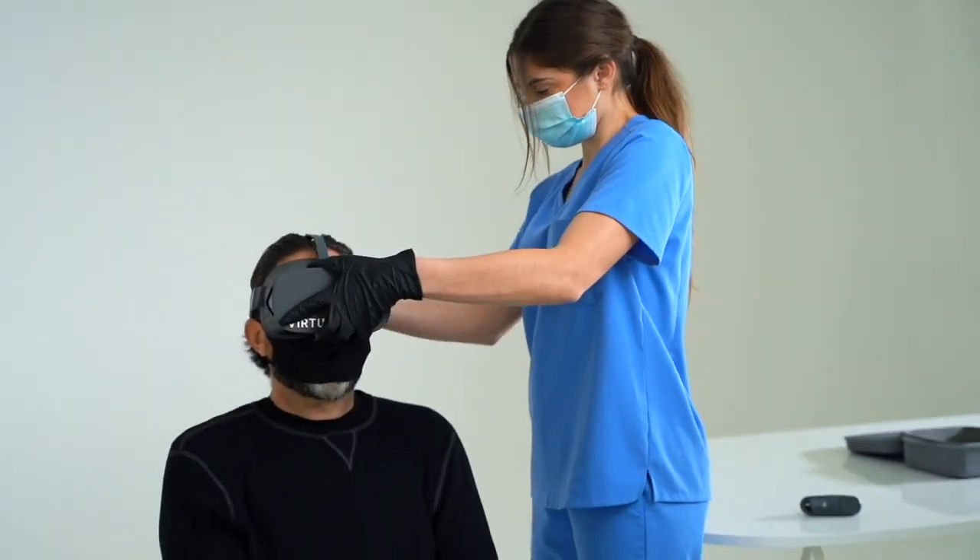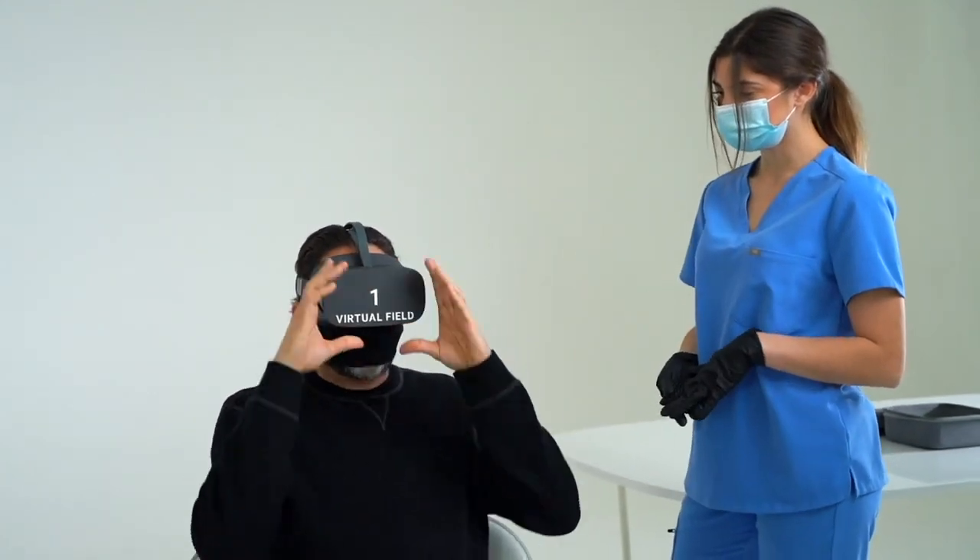If you prefer, your patients can wear their distance glasses or contacts instead of trial lenses. Most glasses will fit comfortably into the headset.